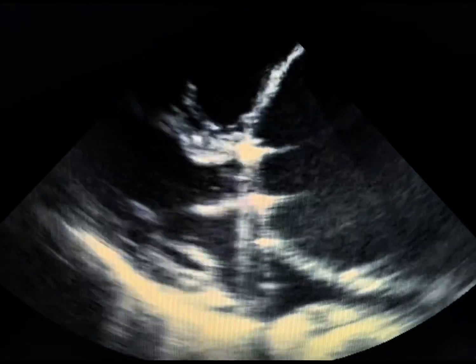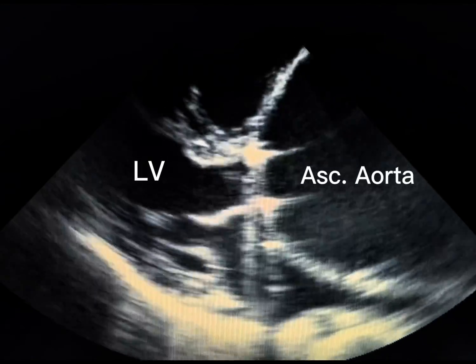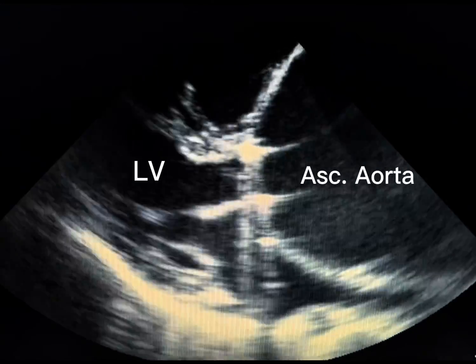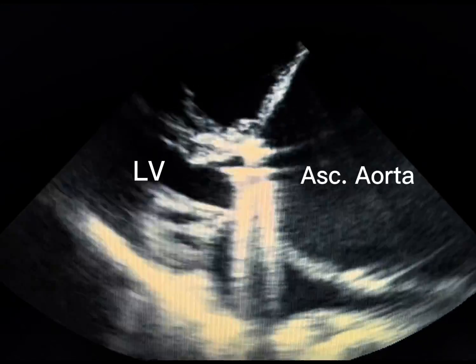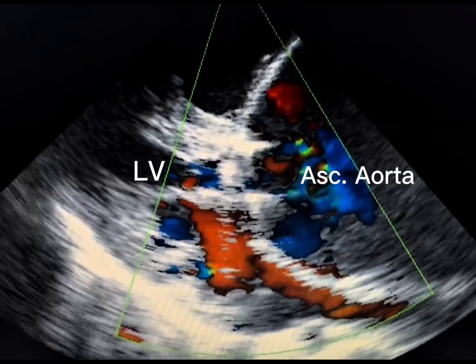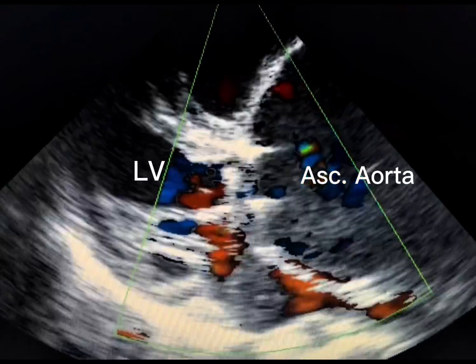This echocardiography involves a 19-year-old teenager with a history of aortic valve replacement (AVR) 10 years ago due to bicuspid aortic valve. Unfortunately, ascending aortopathy was overlooked during the preoperative evaluation, and several years later, severe dilation of the ascending aorta became an issue. The patient was admitted to the hospital due to dyspnea and pulmonary congestion, and the echocardiography revealed significant pulmonary hypertension.